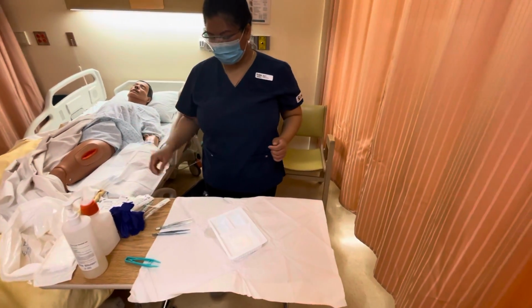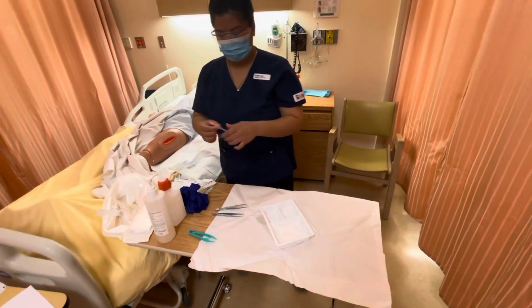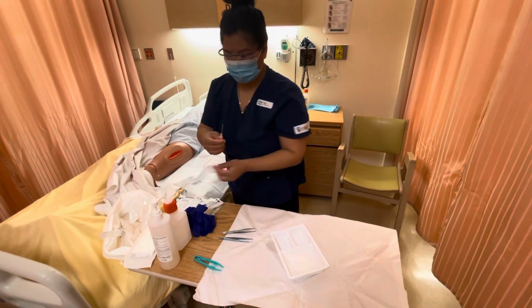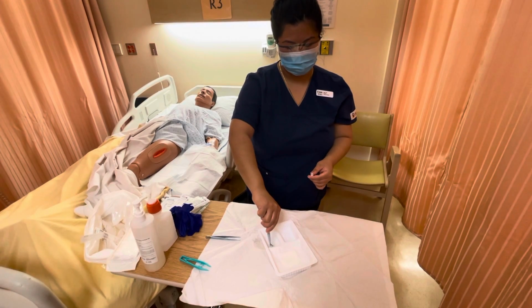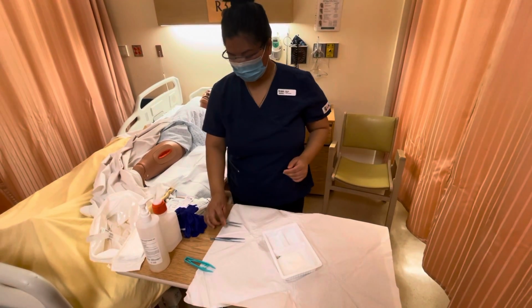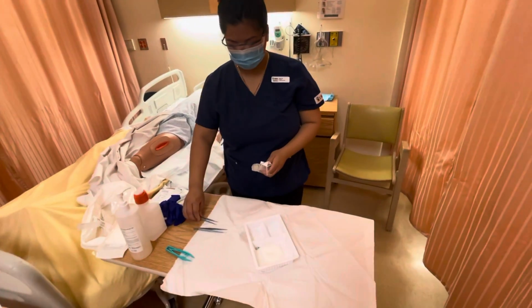So then now I'm gonna open up my Angiocath. And then I'm gonna remove the cap. And then we're gonna drop that into our sterile dressing tray, and this will go into the sharps disposal. And then next thing I want to do is open up my syringe, and then peel it open.